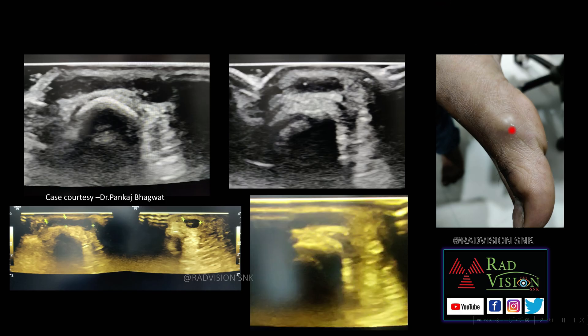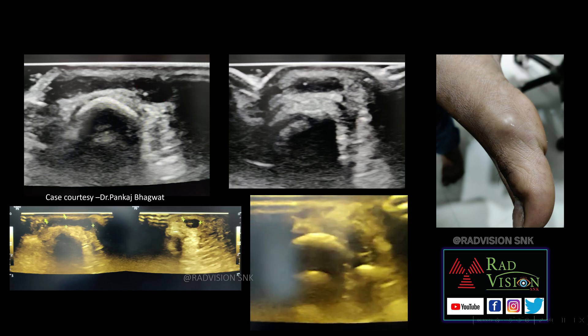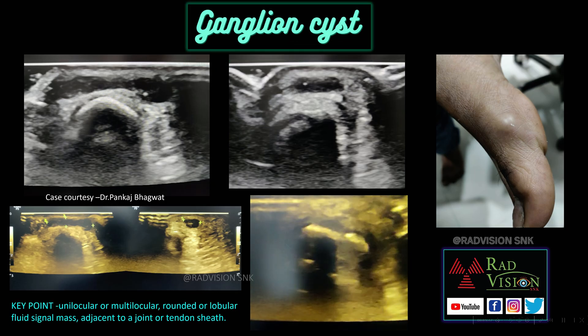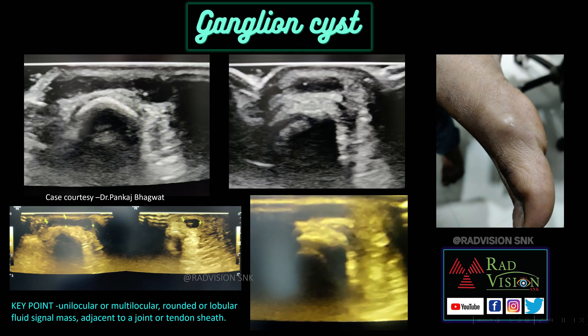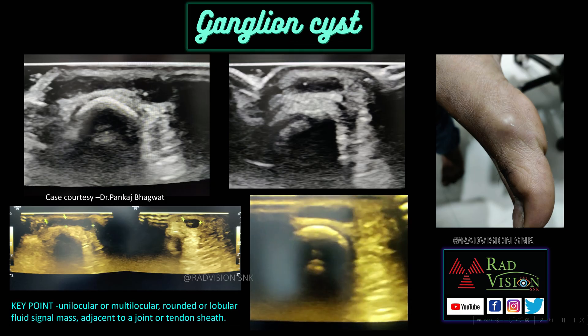Here there is a soft tissue swelling on the medial aspect of the foot, and you can see a cystic lesion or fluid collection-like mass lesion in close proximity with the tendon — this was a case of ganglion cyst. Whenever you see unilocular or multilocular, round to lobular fluid-containing cystic lesions close to the joint space or tendon sheath, definitely suspect ganglion cyst.